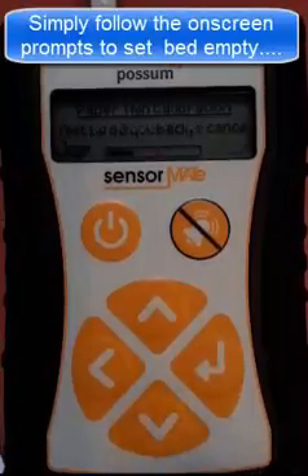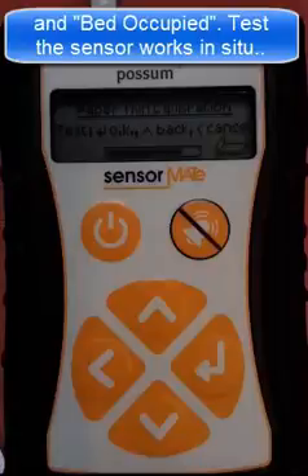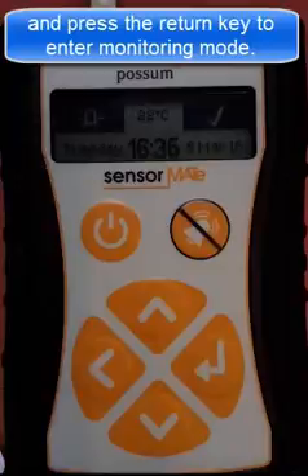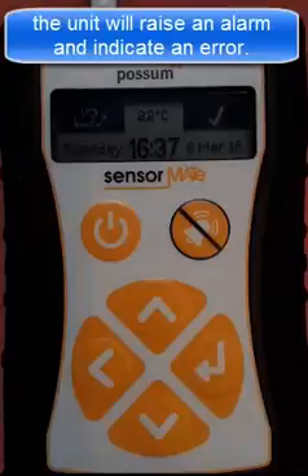Simply follow the on-screen prompts to set the bed empty and then the bed occupied. Test the sensor works in situ and then press the return key to re-enter monitoring mode. The error detection circuitry of the Sensormate can now be tested. Simply place your hand in direct contact with the mat and the unit will raise an alarm and indicate an error on the display.